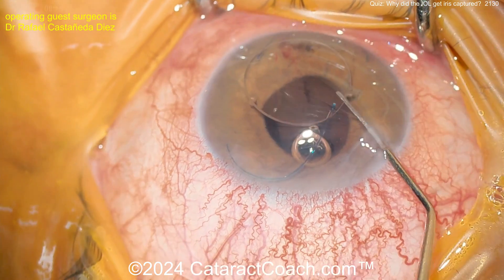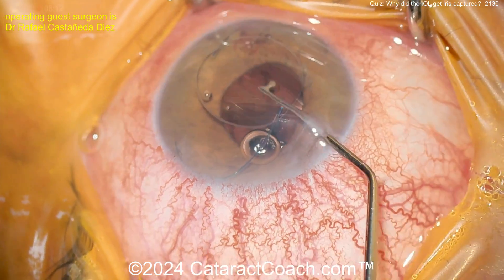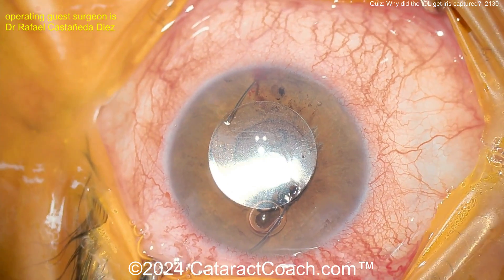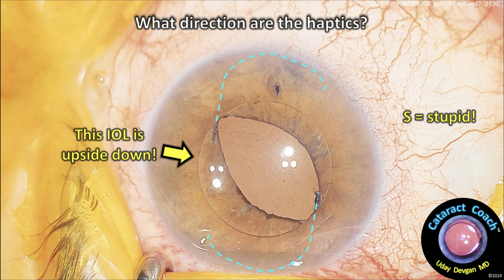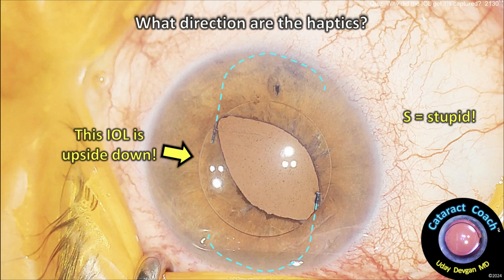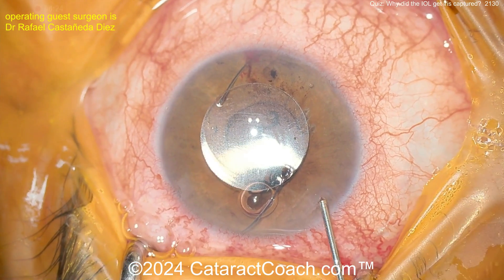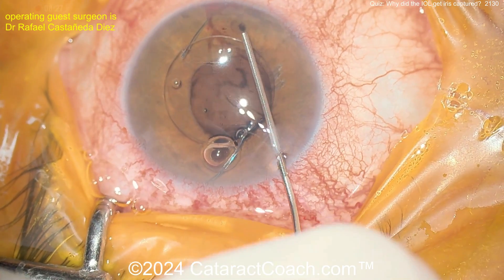Back to our regularly scheduled program — have you figured out why? Look at that lens. What's wrong with it? I bet you figured it out now. It's upside down. What direction are the haptics? Remember: when the haptics look like the letter S, S is stupid — I don't want to be stupid. That means the lens is upside down.